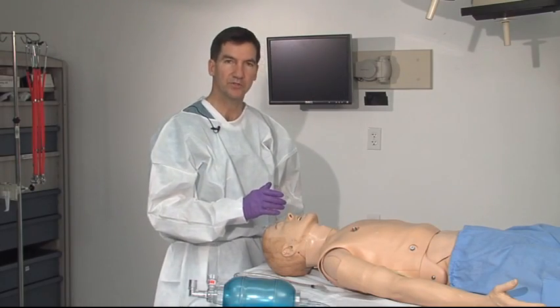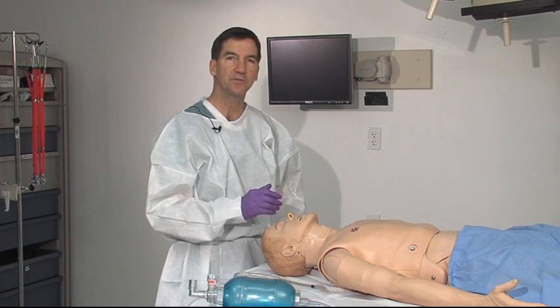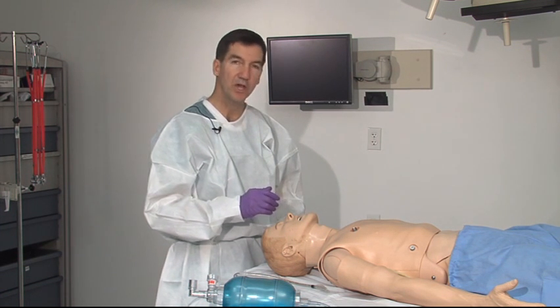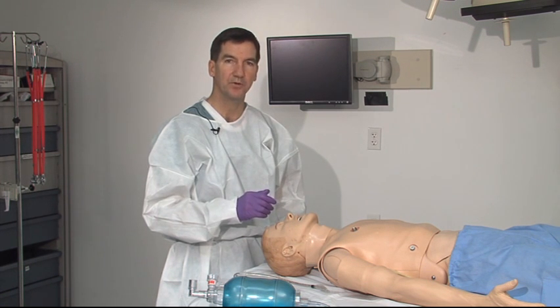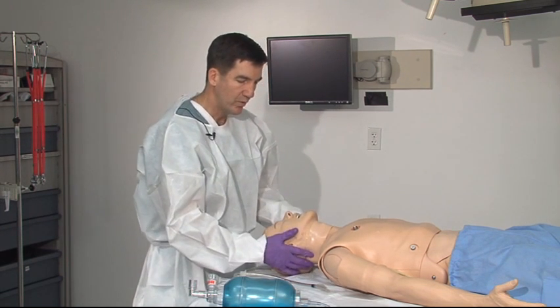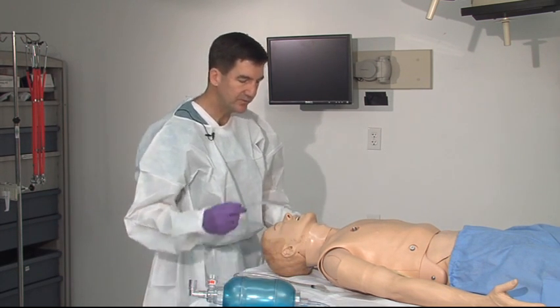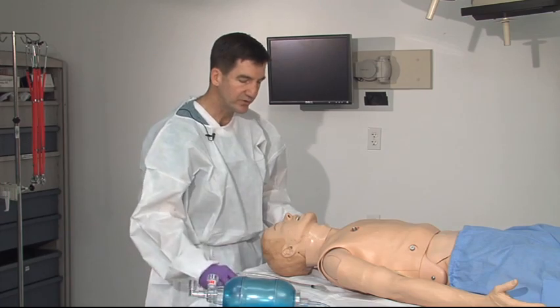Normally, your resuscitation team would be bagging the patient. When you're prepared, the guideline is for the provider to take a deep breath and hold it, just as your patient will be holding the breath as you prepare to do your intubation. With the head slightly tilted, making sure that suction is applied so all the secretions are out of the way.